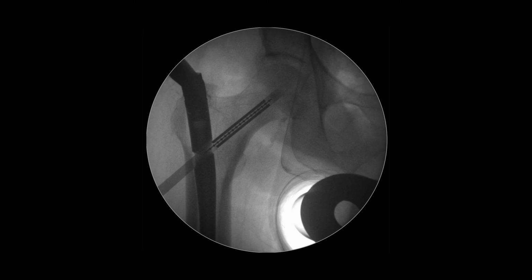The aim is to get the lag screw in the middle of the femoral head, so that the tip-apex distance, meaning the sum of the distances from the tip of the lag screw to the apex of the femoral head in the AP view and lateral view, is below 25 millimeters, so as to minimize the risk of cutout.